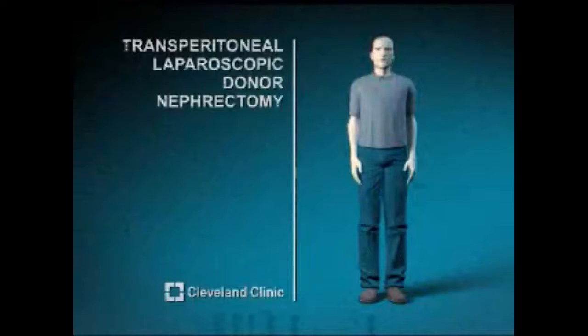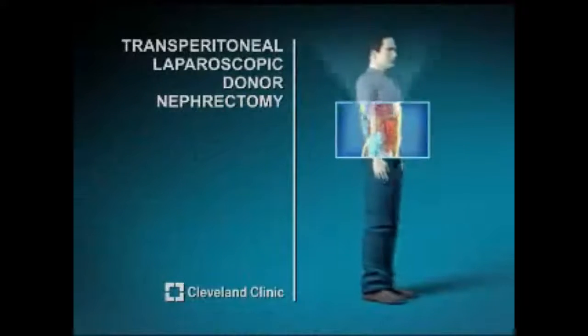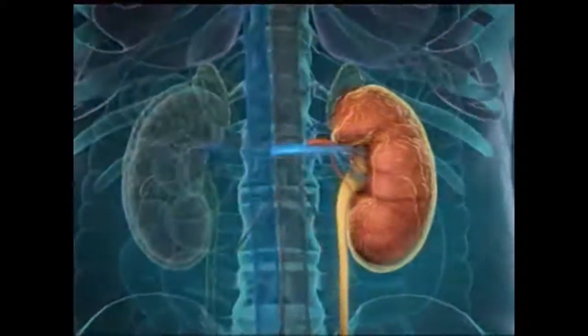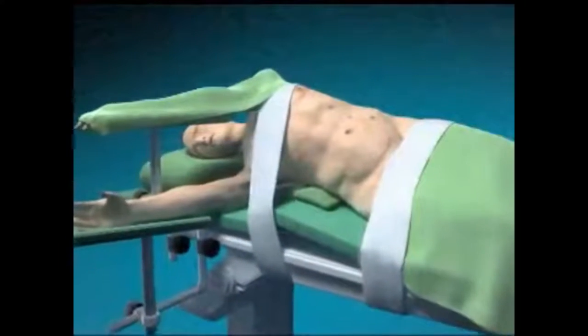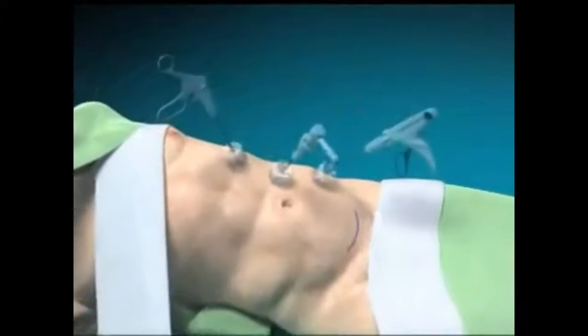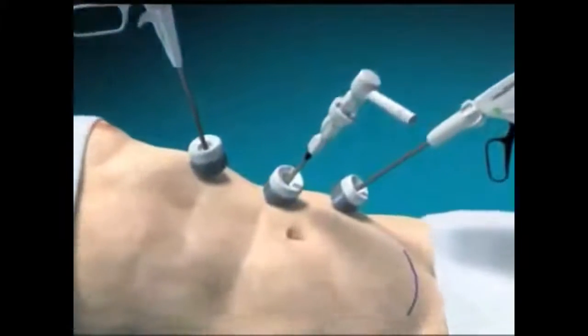It now has a well-defined safety profile. In the past 10 years, significant increases in living donation have occurred because of new methods that decrease morbidity for the donors. The new procedure is called laparoscopic living donor nephrectomy. The laparoscopic donor nephrectomy is now an established minimally invasive procedure for removal of a living donor kidney. Cleveland Clinic surgeons have pioneered the development of this procedure. There are three small incisions the size of a quarter on the upper abdomen for placement of slender laparoscopic instruments. The kidney removal site is in the bikini line.